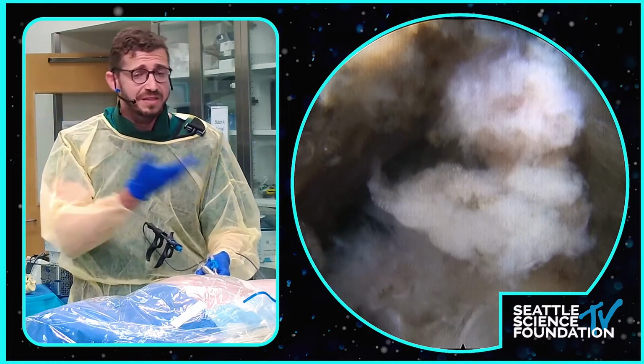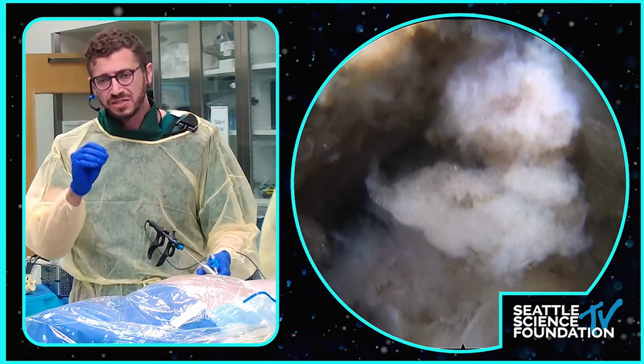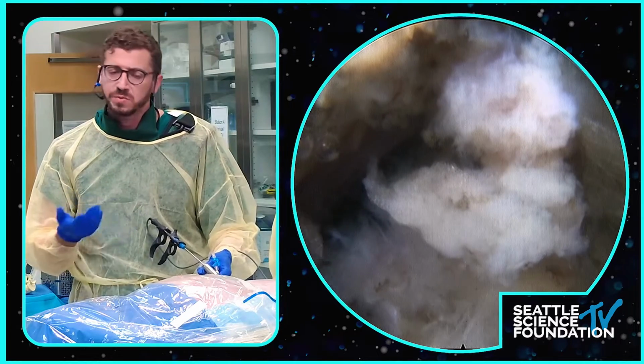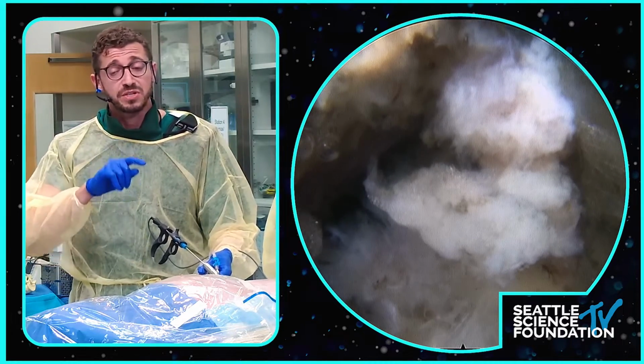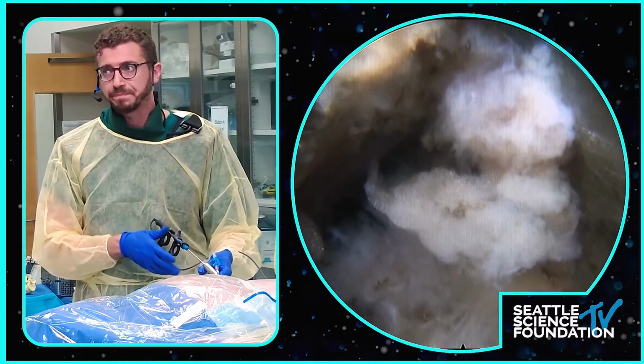If you see all that free, then the disc must have resorbed. A lot of times there are adhesions or a tiny disc herniation that's still causing the patient's symptoms. I have seen those patients honestly get better, but in that situation you have to be super OCD that the nerve is completely decompressed. At least that's my opinion.